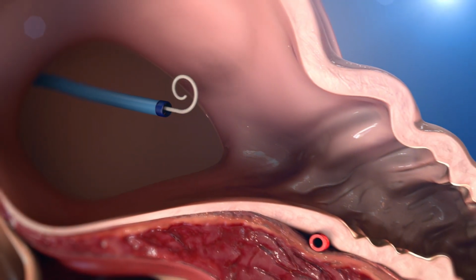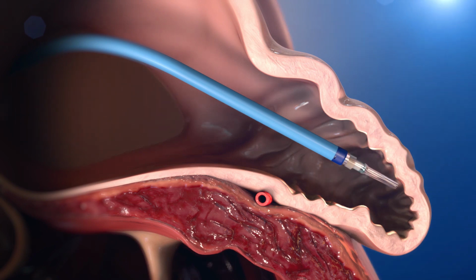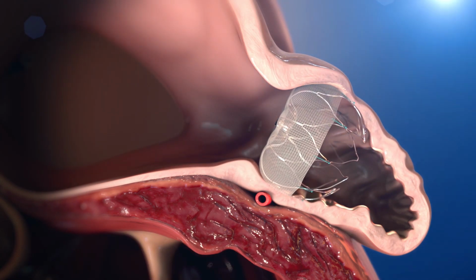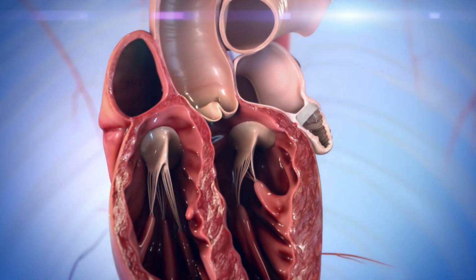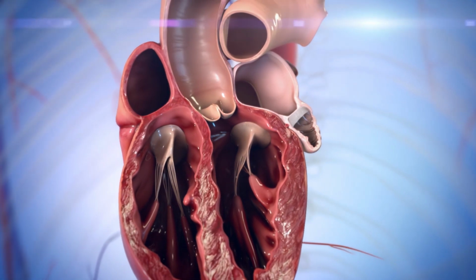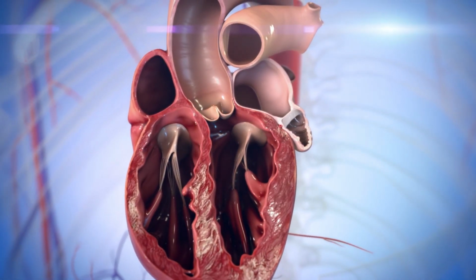Now, the beauty is, a lot of people, as we talked about before, need to be on blood thinners to prevent stroke, but there's a large percentage of the population that struggles with recurrent bleeding being on blood thinners. So the Watchman is a device that we are able to implant, exclude the area of the heart where blood clots come from, therefore decrease the risk of stroke, and we are able then to stop using high potency blood thinners and then decrease the risk of bleeding.